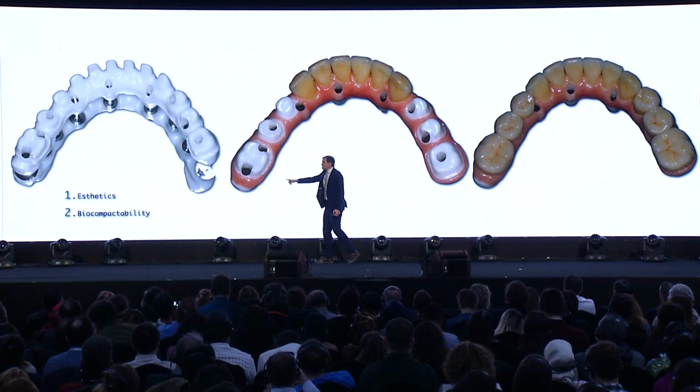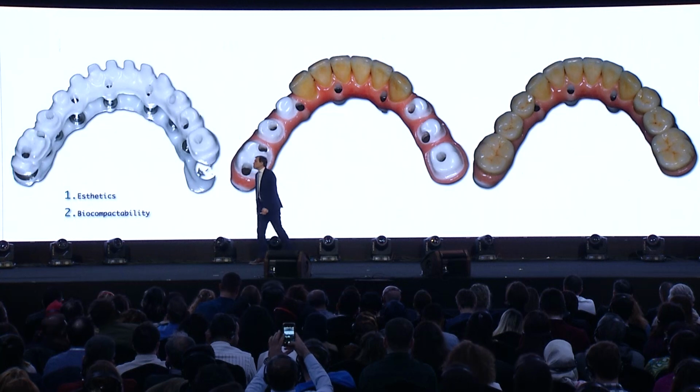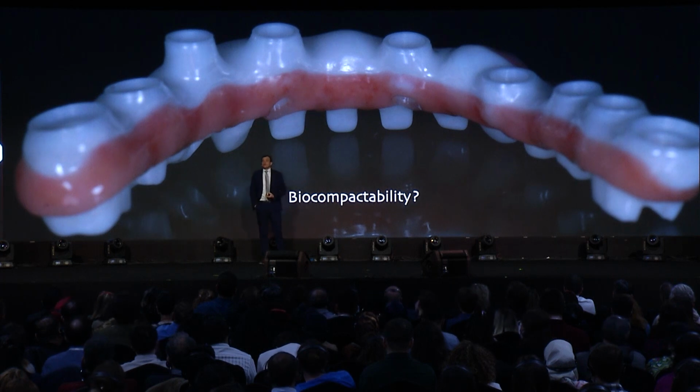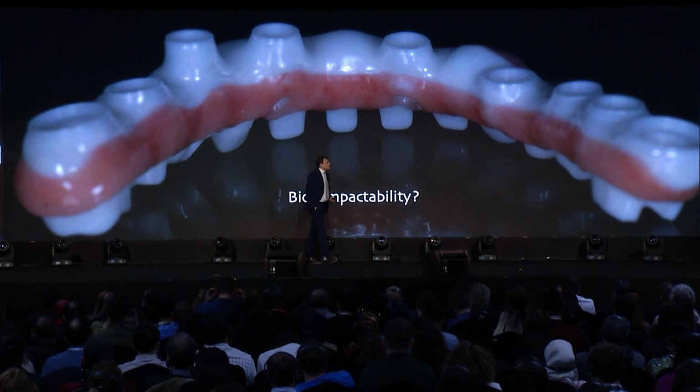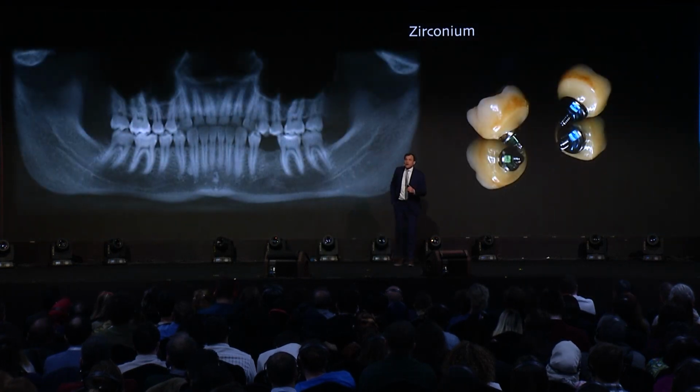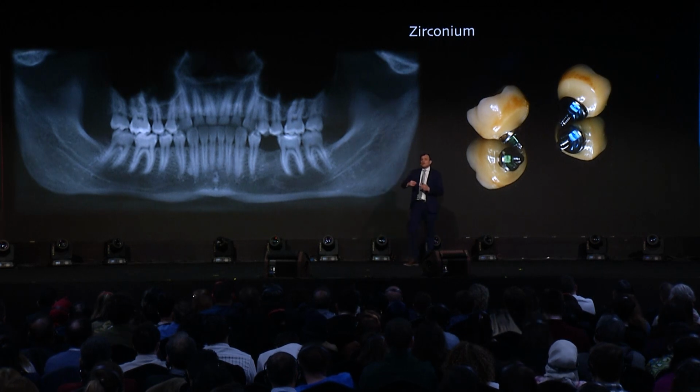I'm going to discuss now a little bit about zirconia, why I think this material should probably be the best choice. And we all have, I always say this, in our practices, in our career as clinicians, some cases when you performed better than you expected.